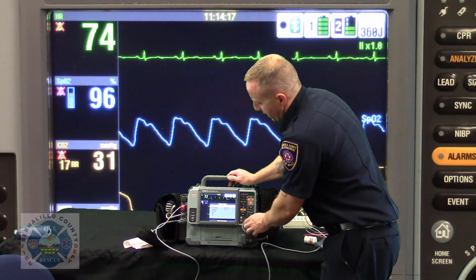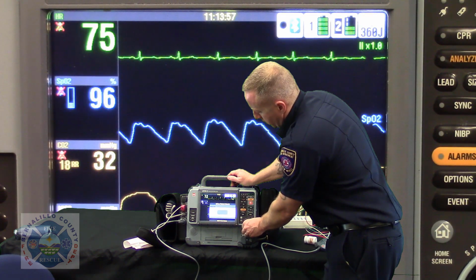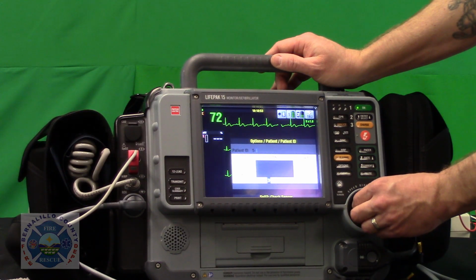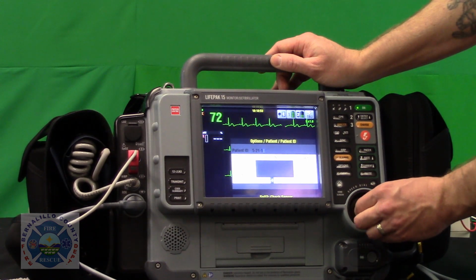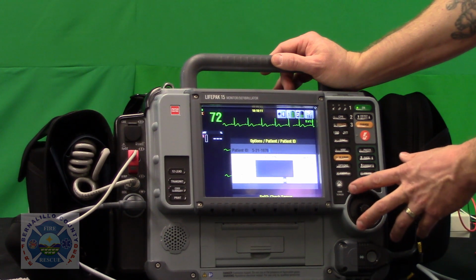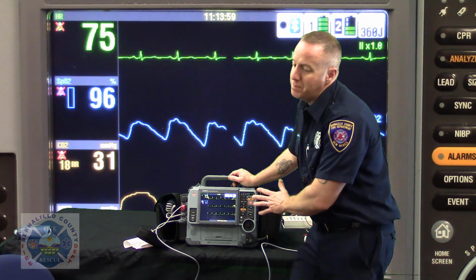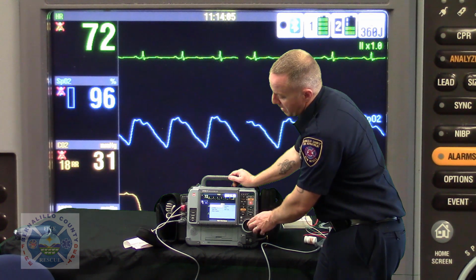So we'll go back and make that correction for the patient ID, and we're just going to go 5-21-1978. Now, do you see how that looks a whole lot more like a birth date versus the other way that I did it? That's the thing, you need to make sure that we're saving time, we're saving heart muscle here, and something as simple as a data entry misstep could become a real hindrance for getting what we want to have happen.